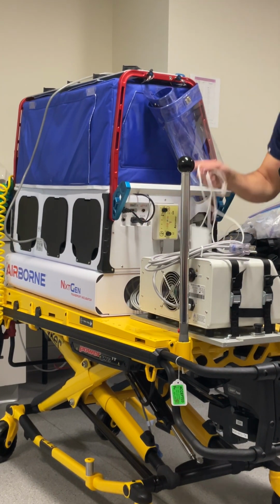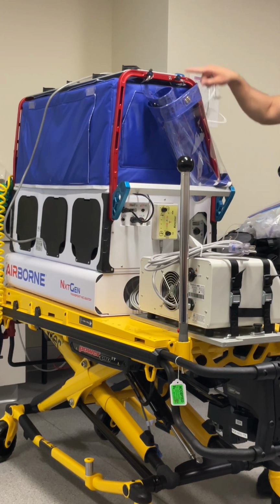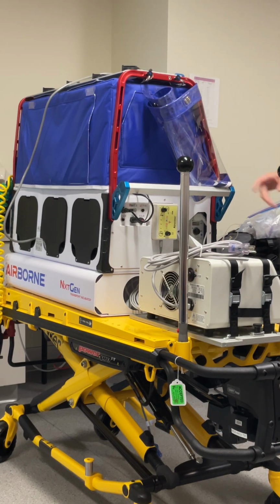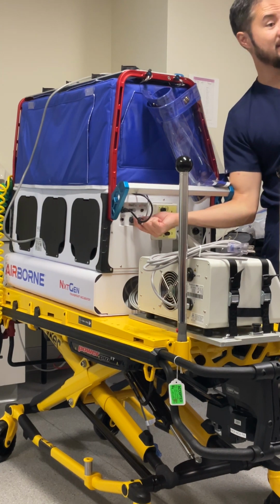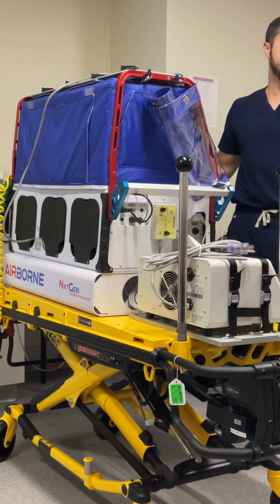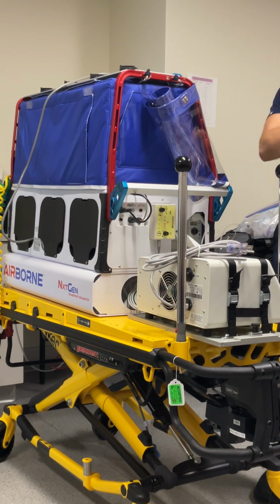On this side, this is the light. If you take everything apart, that's something to remember is connected. So that light is still within the 2 chambers. Another thing that is connected, if you're taking all of this apart to do a clean, is that there is now a heated mattress in the bottom. So it is actually connected. What this is doing is just giving a very mild heat to make sure the mattress isn't cold. It's actually not meant to thermoregulate. It's just so that if we put the baby down, it's not going onto the cold.